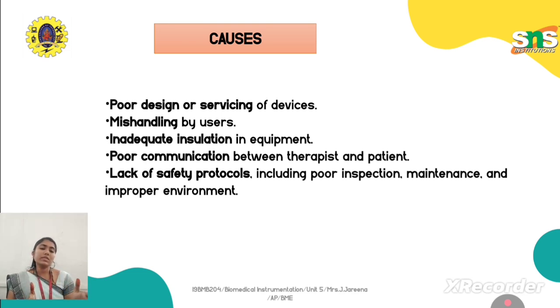They should say, for this reason we have kept this device, in order to monitor your vital signs, like that. They have to explain each and everything to the patient, to calm them, and to make them understand the importance of doing this particular treatment. If you do it this way, then the patient will also be very careful about what is happening around them.